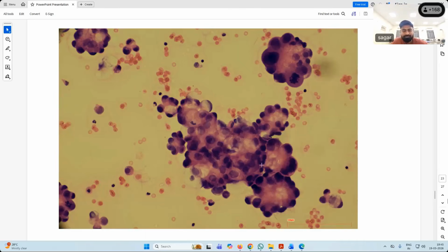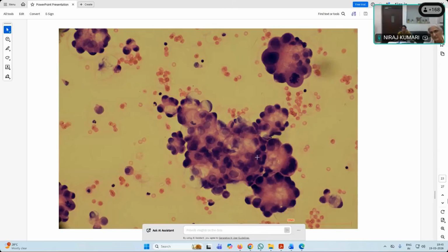So 3D clusters, and these are cohesive, maybe not a papilloid cluster, but some kind of large clusters of cells with multiple, maybe forming tubules or something. Okay. So you can see these multiple tubule-like structures aggregated together.